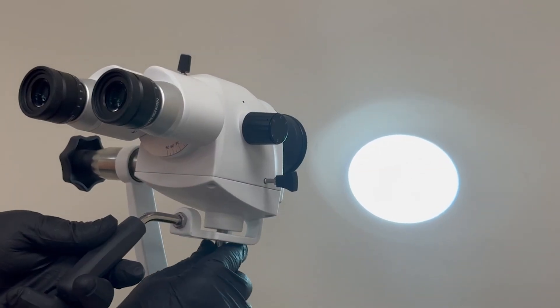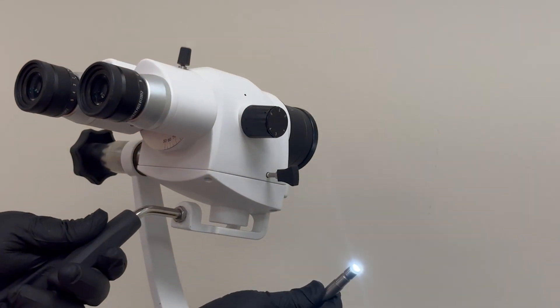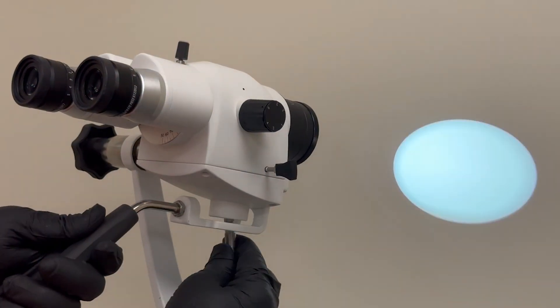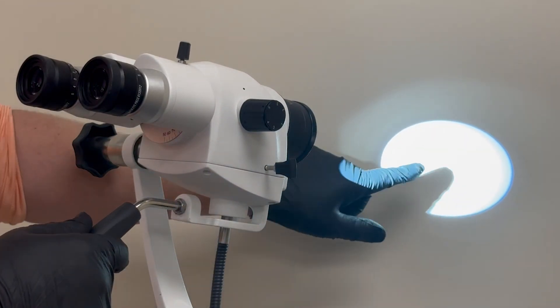Siler Colposcopes utilize technology known as coaxial illumination. This innovative approach to lighting transports light directly to the optics, ensuring an illumination path that is perfectly aligned with the viewing axis.